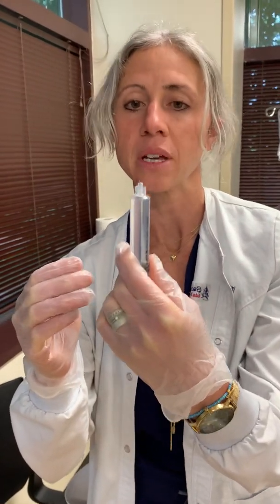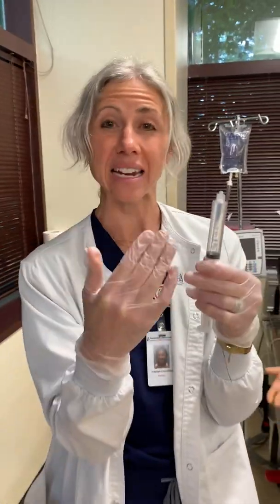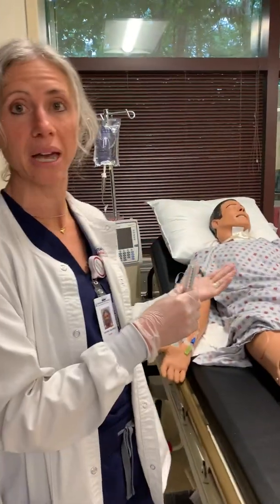No air bubbles, so I safely know I verified my drug. I know that I have 0.2 mLs of my morphine, so I verified that. I've got it nice and diluted, and then I can return to my patient.